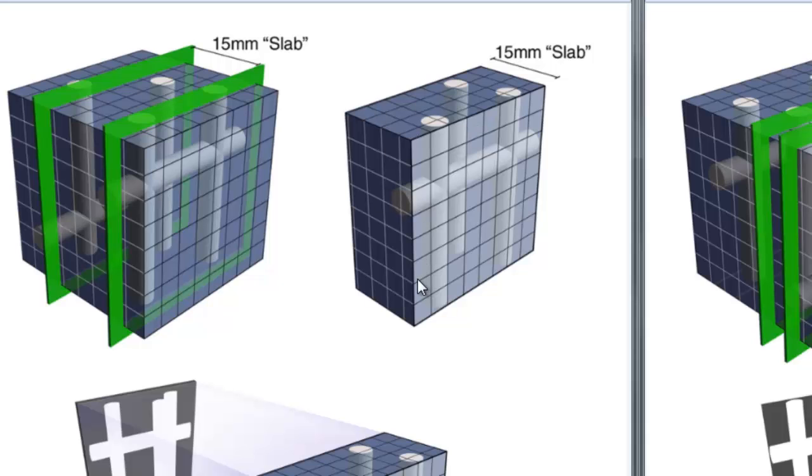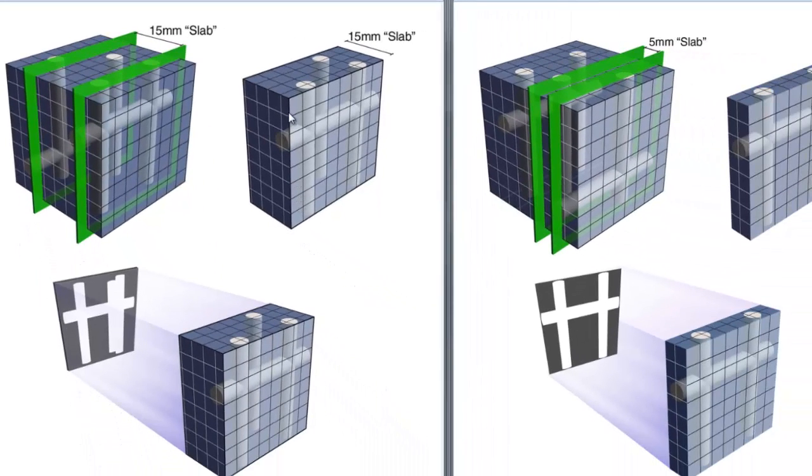That is what we're projecting along into our 2D representation following that same maximum intensity rule. Looking through each stack of voxels where this one is dark, this one has some bright contents, it's going to end up bright and so forth. Depending on what thickness we set we're going to overcome that problem of too much superposition of these contrast opacified arteries.